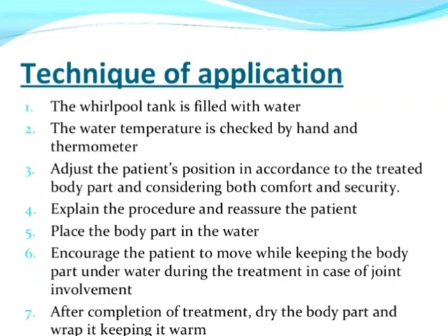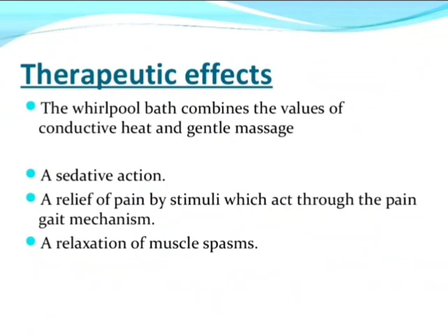Then explain the procedure, reassure the patient, place the body part in the water, and we encourage the patient to move while keeping the body part underwater during the treatment in case of joint involvement. After completion of treatment, we have to dry the body part and wrap it to keep it warm.